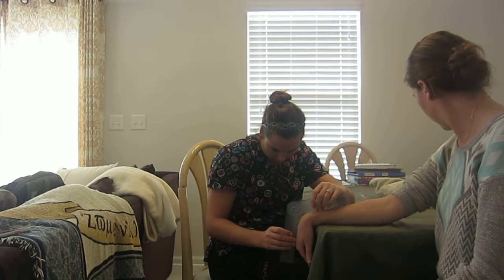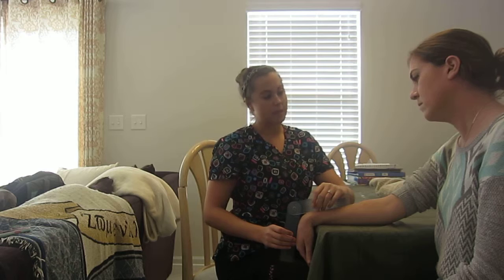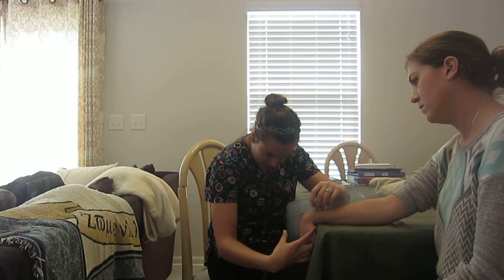Good. And I'm getting 72 degrees, and the norm is 80. So I'm just going to do this passively. And now I'm getting 81.